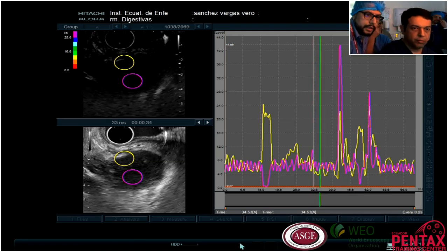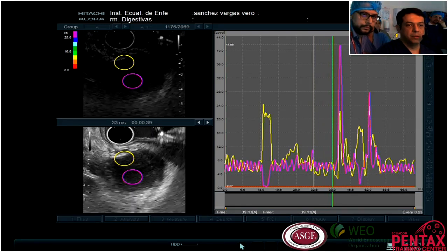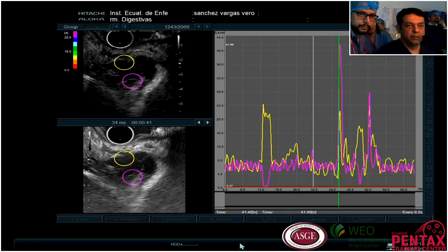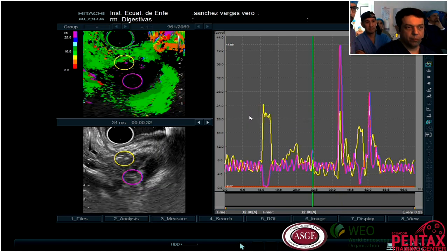Yes. This color map will depend on the area and the time at which we perform a captation. So, for example, here we have more.